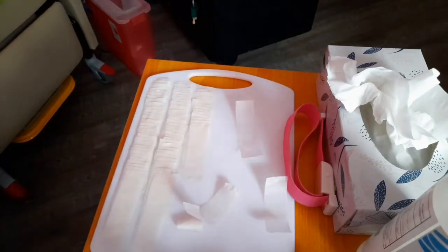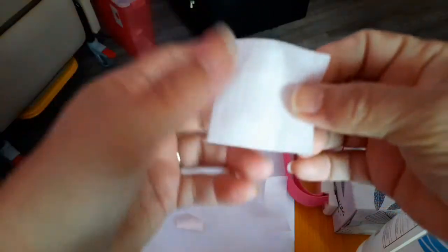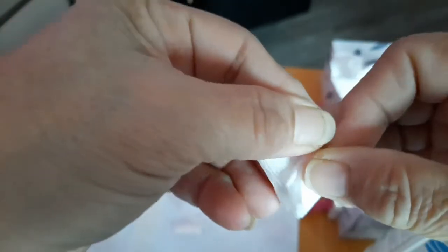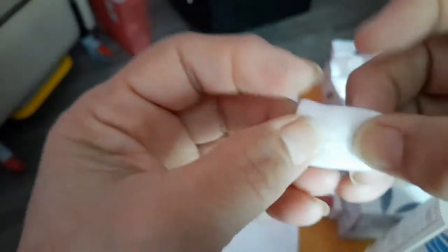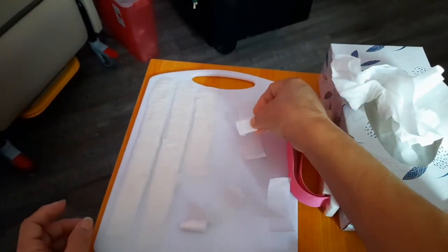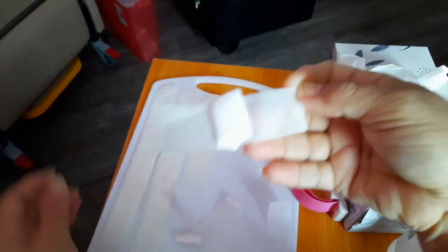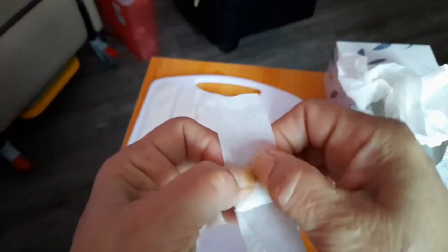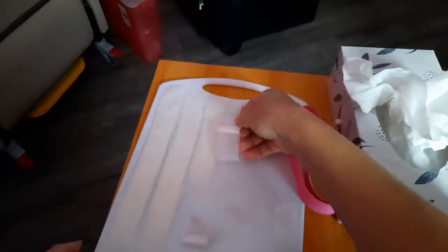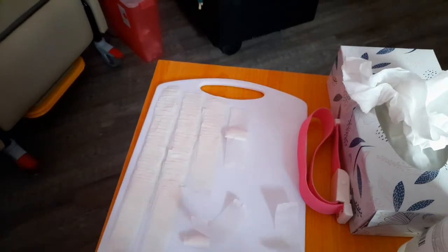Let me show you what we do with each one. I take a 2x2 and fold it in half. I fold it 1/3 of the way, another 1/3 of the way, just like so. And then with that folded part facing down, we're going to land it right in the center of one of the strips of tape, so that you get this. Okay? And then just attach it to your board. And that's what I'm going to do with all those, and I'll bring you back when I move on to the next one.